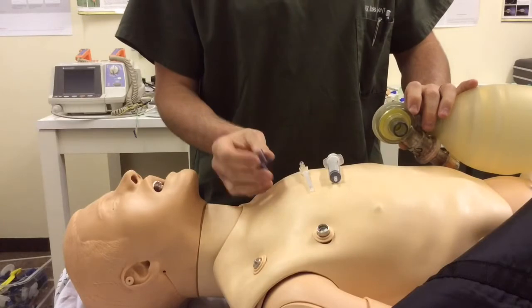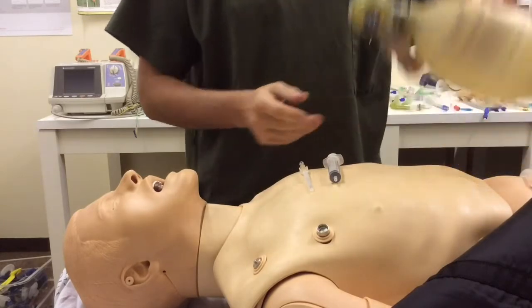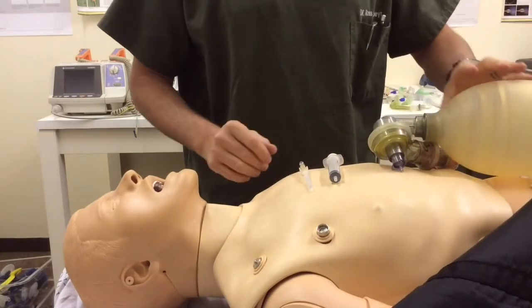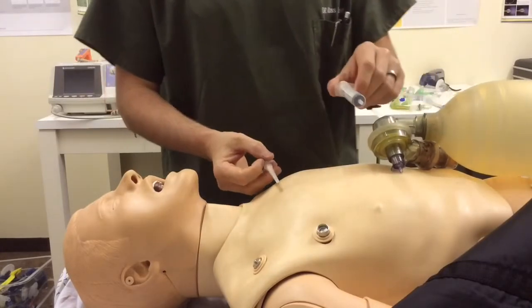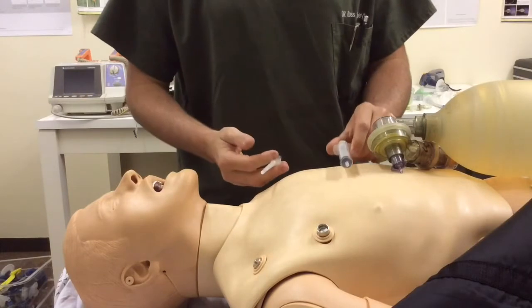I'm going to use this 15 mil connector that comes with a bronchial blocker onto an ambibag just to simulate when I'll be doing my ventilation. In terms of the technique, I've got my 14 gauge angiocath and I've got my syringe, which is basic equipment that I need.